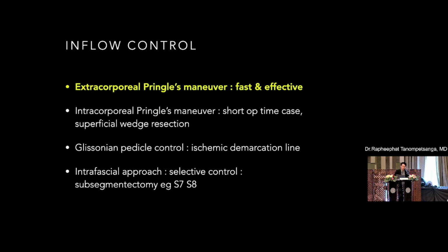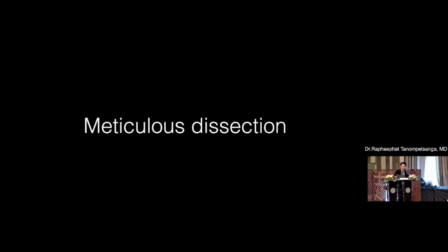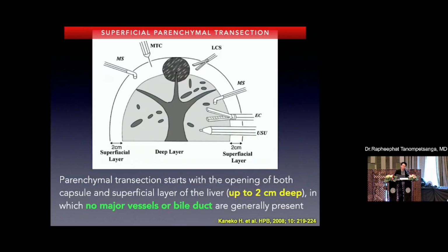For the intrafascial approach, you have to cut the liver first, and then you control the G7 or G8 pedicle. I usually use this technique for the lap subsegmentectomy of segment 7, segment 8. Another one of the principles is the meticulous dissection.